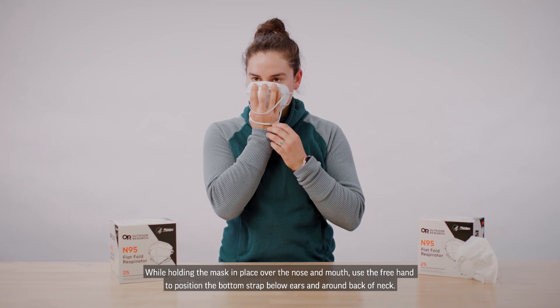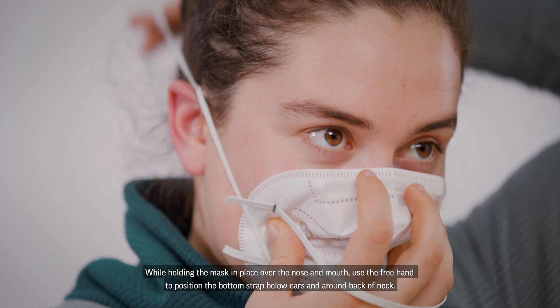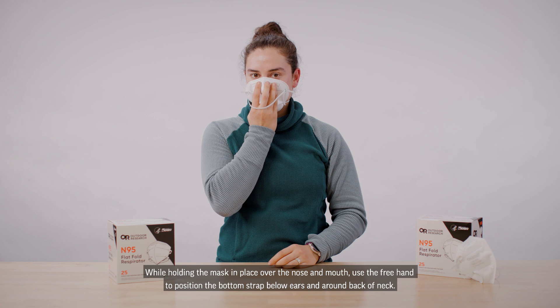Step 3. While holding the mask in place over the nose and mouth, use the free hand to position the bottom strap below ears and around back of neck.